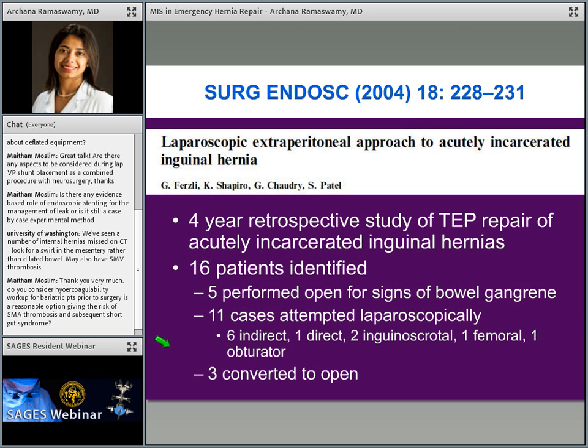This is an obese patient, as you can see, a smoker, who had necrosis of his skin from his incarcerated hernia. And this seems like a patient where you wonder where laparoscopy fits in. Well, that's skin. That's not bowel sticking out there. So when you go in, you find out that all that is incarcerated is omentum. You can reduce that and put a piece of mesh in laparoscopically. You haven't touched anything out here. You haven't gone through a potentially infected area. And it's a very good option for the rare circumstance such as this patient.